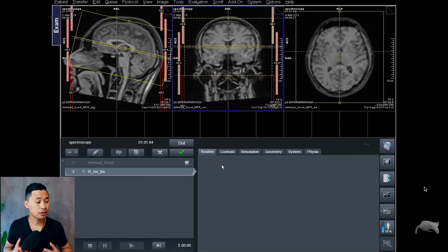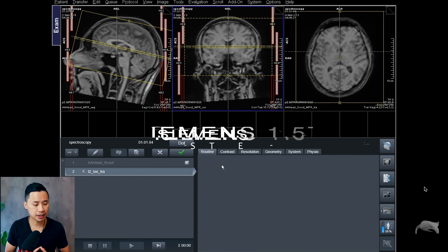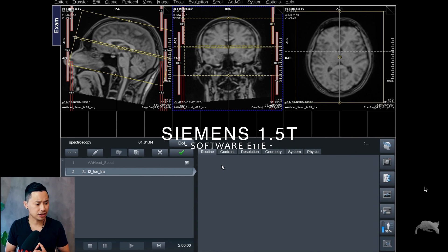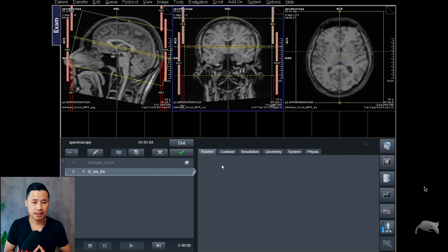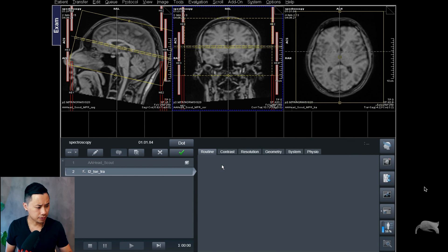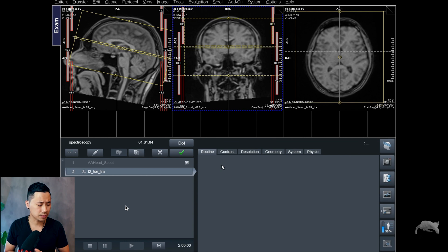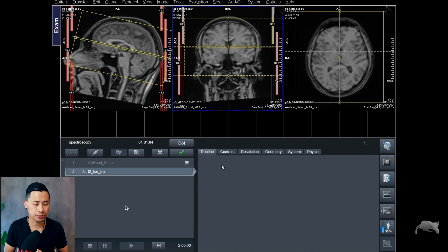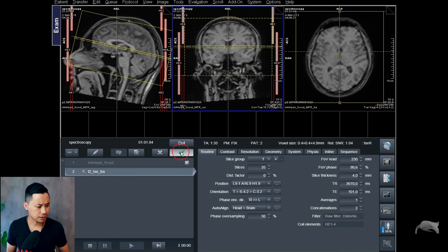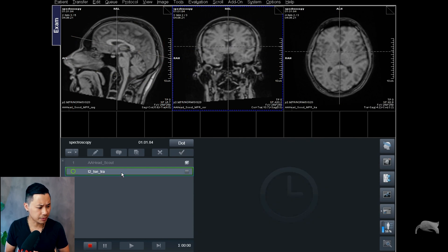Without further ado, let's go to the scanner. We are at the 1.5 Tesla using a standard head-neck 20-channel coil and we are using e11e software. In front of us we have a brain scan. I just did a localizer, and I'm going to run a fast T2 turbo spin echo as a localizer — easy for you to understand and easy for me to do the positioning. I'll run this one, it's around one minute or so.